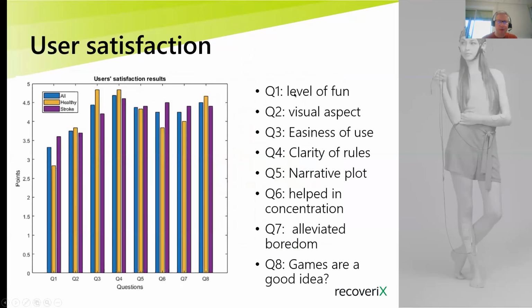If the patient likes it, then it's good because as said, we made sure that the movement is the same, the timing is the same. After 8 seconds, you receive the same feedback, no matter if you use the game or the standard avatar. So there's no disadvantage in using the game. If they like it, just use it.